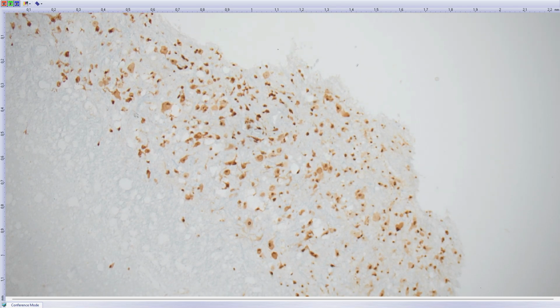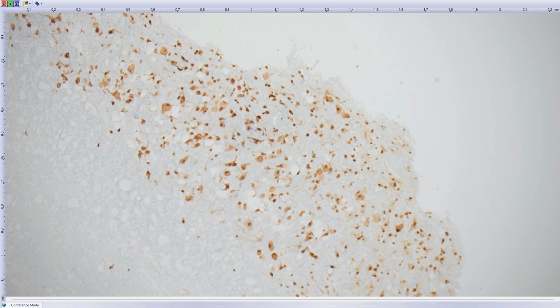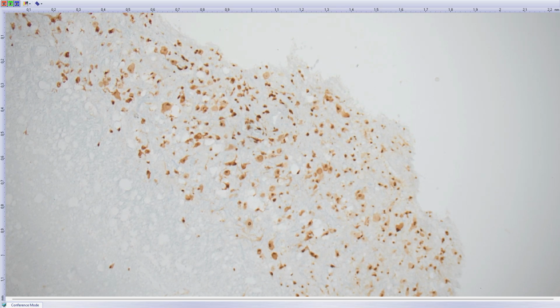What was interesting about this case, the typical imaging findings are a tigroid or radiator-like lesion, and it was not present in this patient. So they had several differential diagnostic considerations, including ischemia and other types of lesions, and they were not sure, and that's why it was biopsied. This is a benign indolent lesion, very slowly progressive, and even after resection, the recurrence rate is quite low, but they may eventually recur and cause some symptoms.